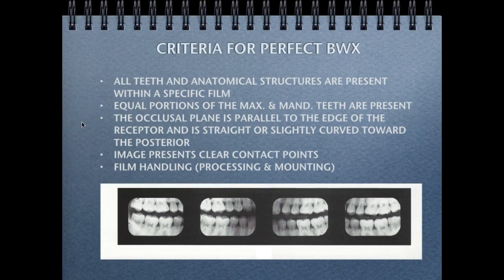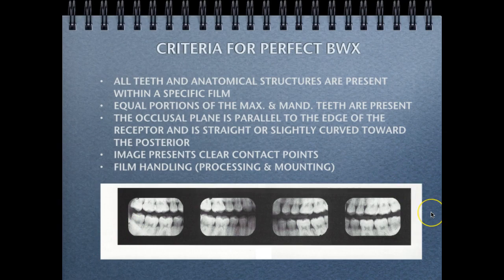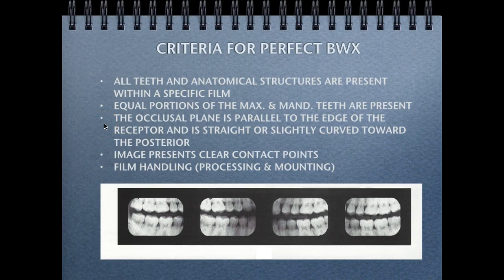For image evaluation of bite wing X-rays, there are standard criteria. First, do you have the required teeth and anatomical structures present within the image? For bite wings, we typically have a molar and a premolar bite wing for both the patient's right and left. Do you have equal portions of maxillary and mandibular teeth? Is the occlusal plane parallel to the edge of the receptor and straight, or slightly curved toward the posterior? This bite wing series meets those criteria well.